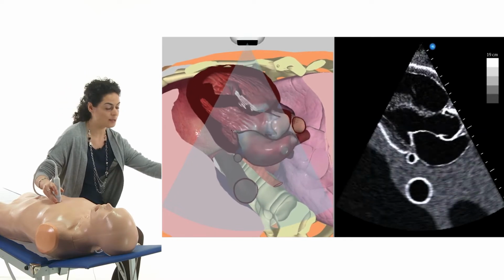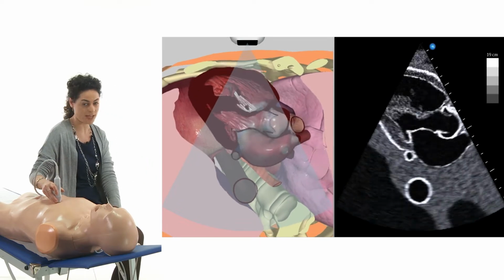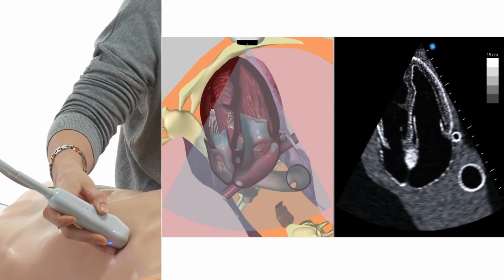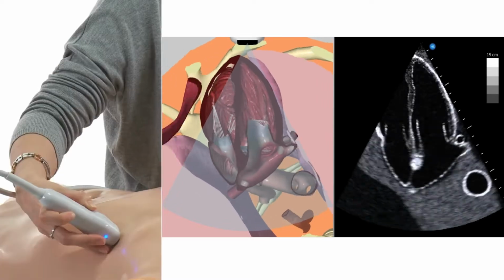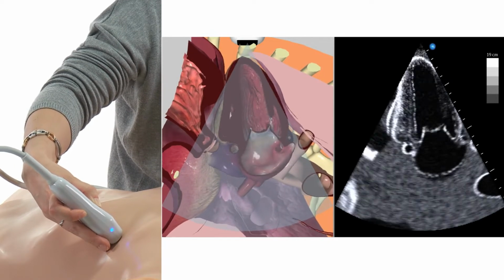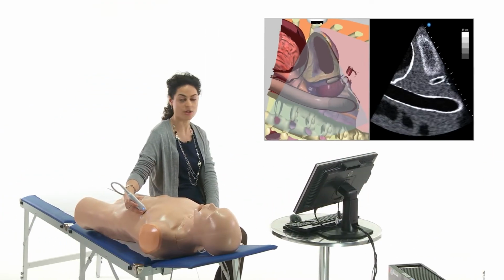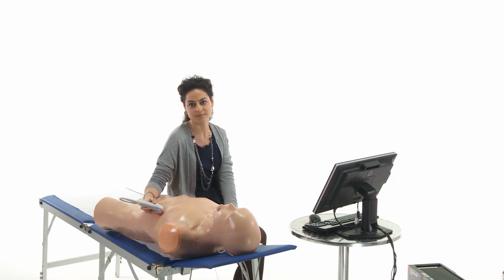Here's the first one, still parasternal, the short axis view, right posteriorly to the left atrium. And when we go to the four-chamber view, apical, here it is again, descending aorta lateral to the left atrium, and in the two-chamber view, we can appreciate the long axis of the same portion of the aorta just by tilting the transducer a bit. And here it is. So actually a few views which allow you to recognize different segments of the aorta.